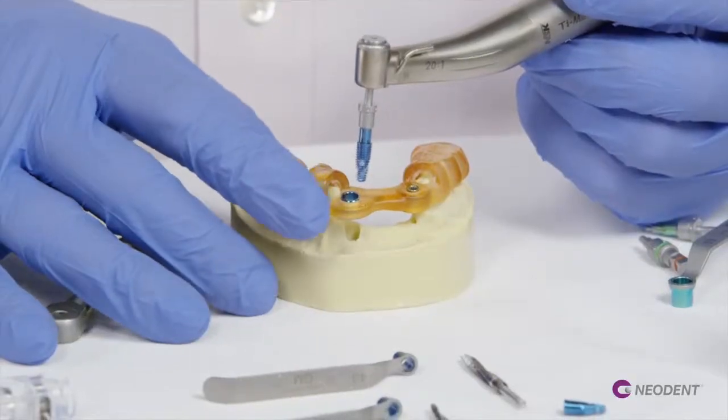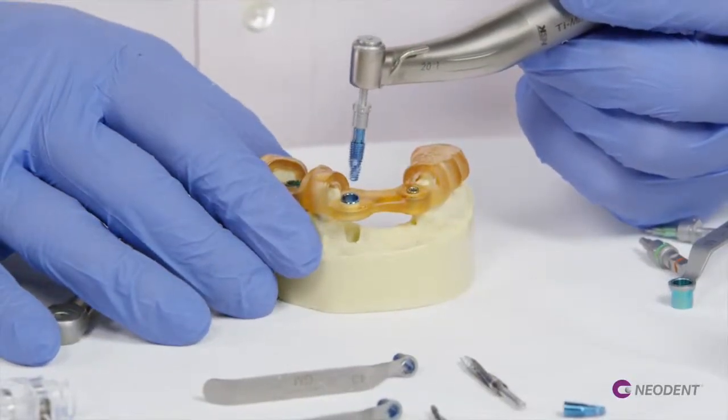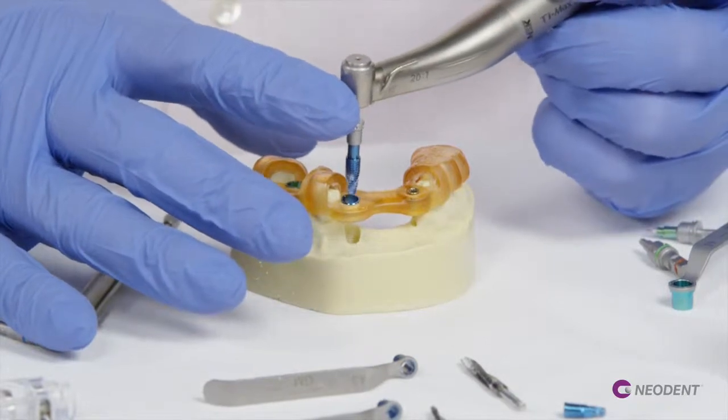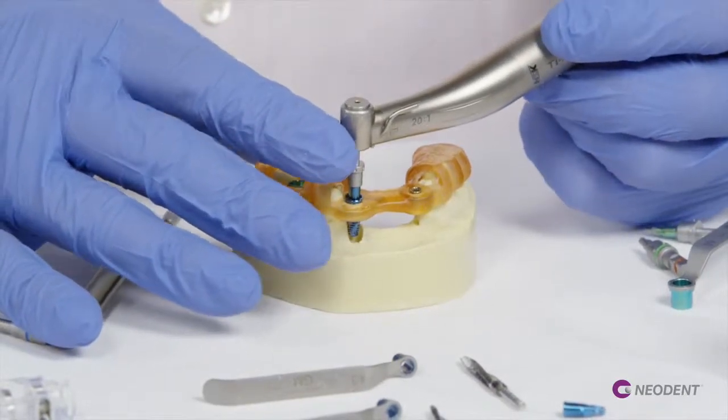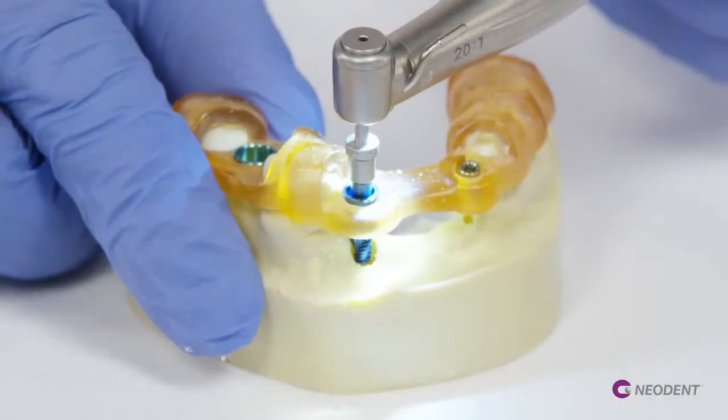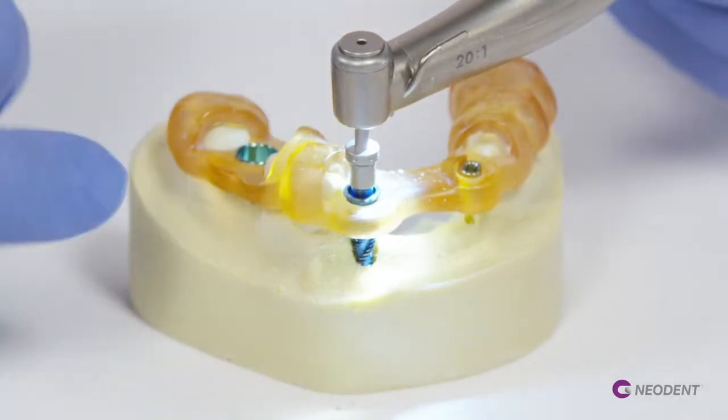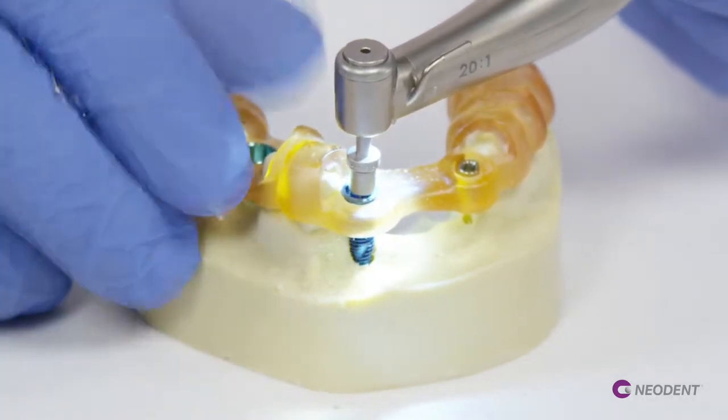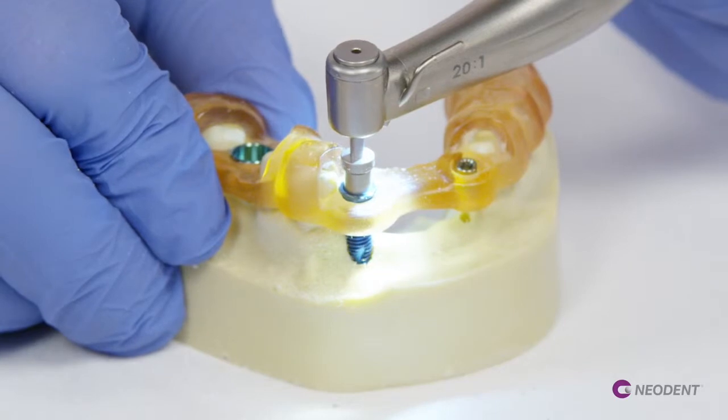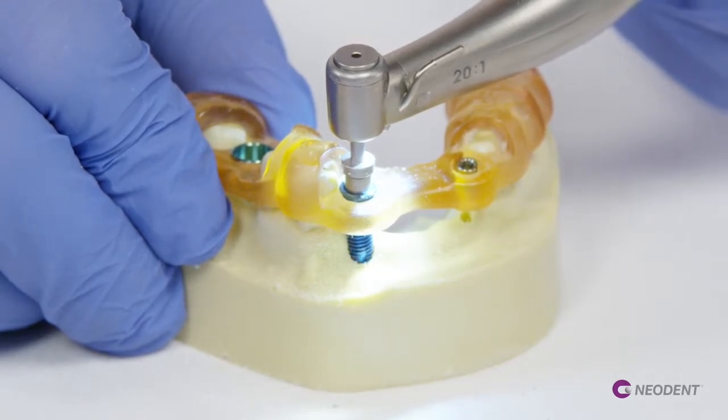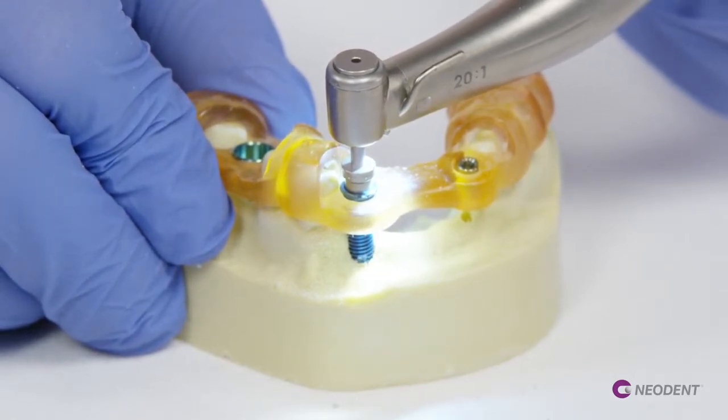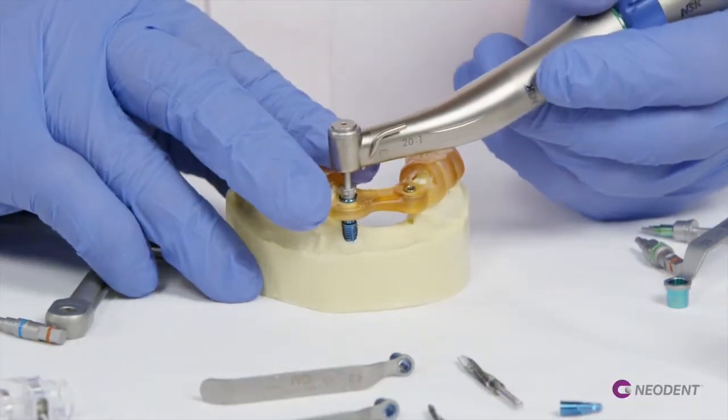Our 4.3 by 11 and a half GM Helix implant is going to be placed down through the sleeve. Stepping on the pedal, letting the implant grab into the osteotomy, and I'm watching that vertical stop on the side of our implant driver advancing down. I want to stop just short of the sleeve.